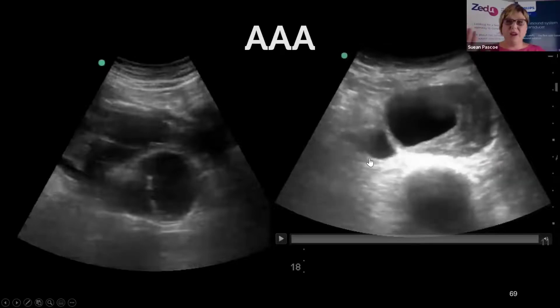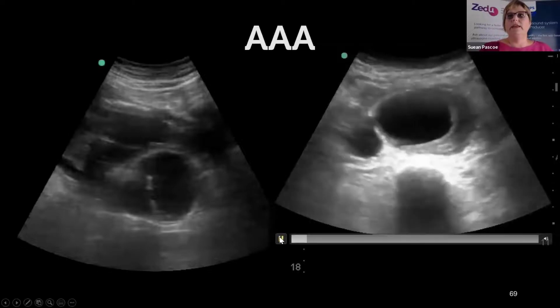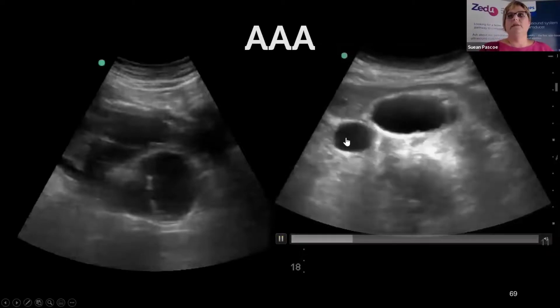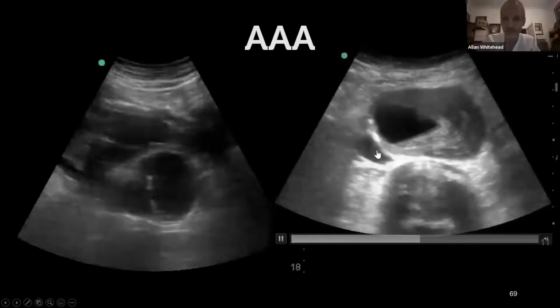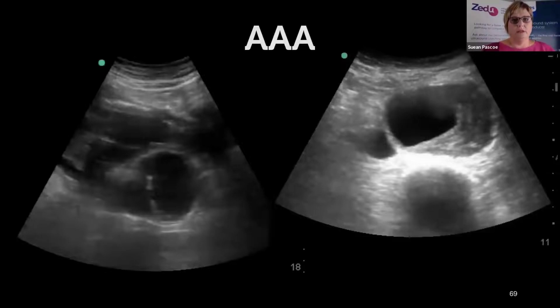But see how that one still image can convince you of lots of different things. The importance is to take images that tell the story, the true story of what was happening. So if I just play that again, Sam, you can see there that it starts to be very clear that that's IVC. Yeah, you're right. And we see it nicely because this big aneurysm is actually making a nice window for us now, so we see it in much better definition than we otherwise would.